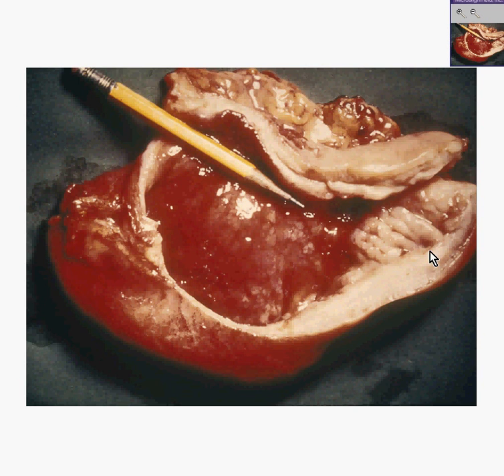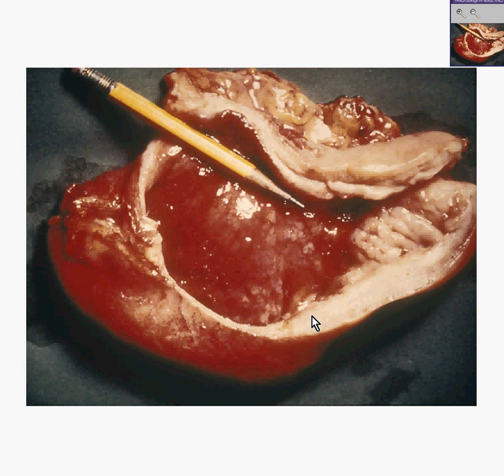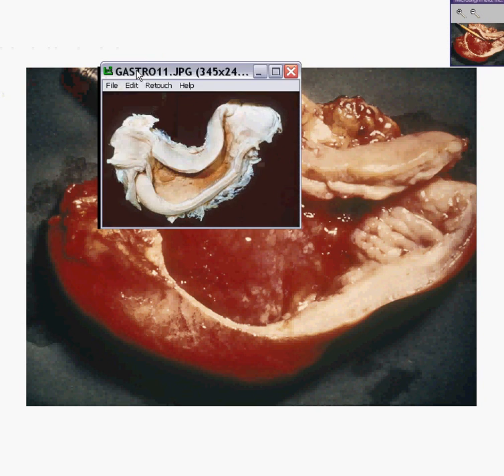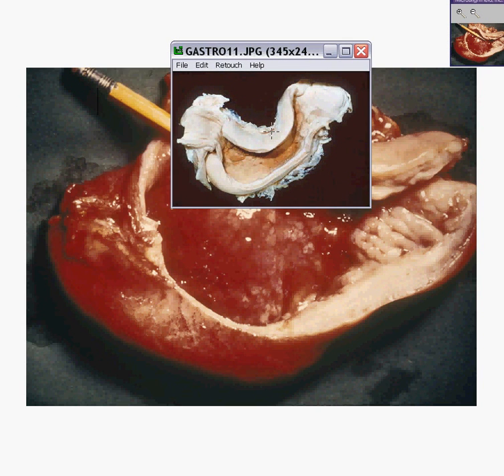It gives the stomach an appearance where the wall is very diffusely thickened. There may or may not be much evidence left of a mucosal tumor. And for this reason, it gives the stomach — like you see here, and another one that I found over here — an appearance of one of those leather bottles that you drink wine out of at the Greek festivals.